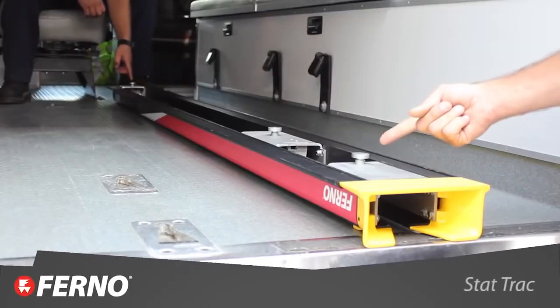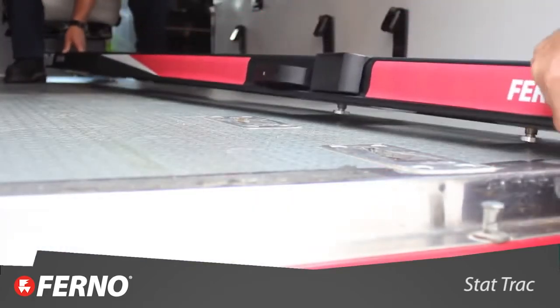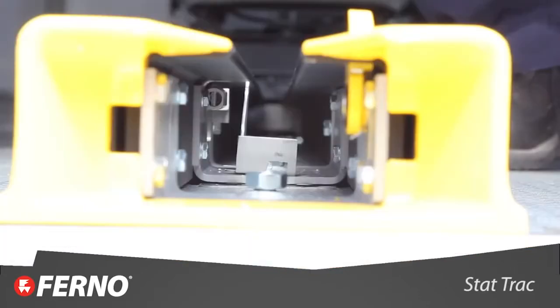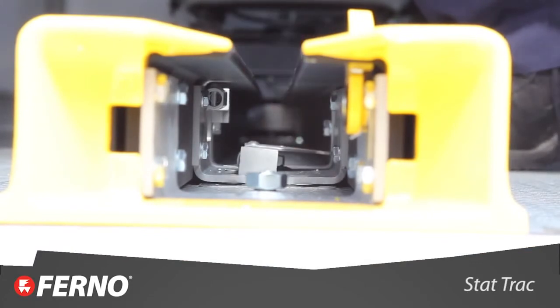There are three posts located on the bottom of the stat track that fit into the floor plates. The floor plates have a keyhole mount, so when the posts go in, you slide it forward into the keyhole. There is a lever in the center of the stat track that you slide over to lock into position.